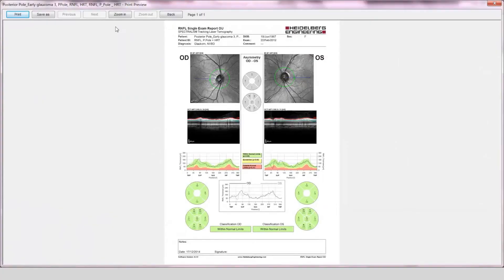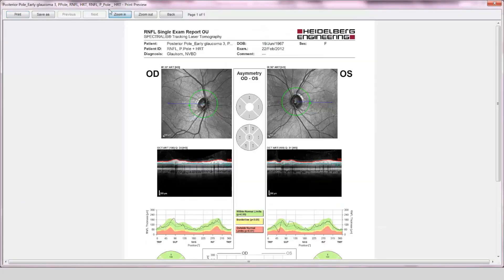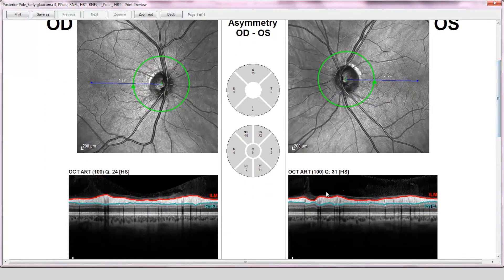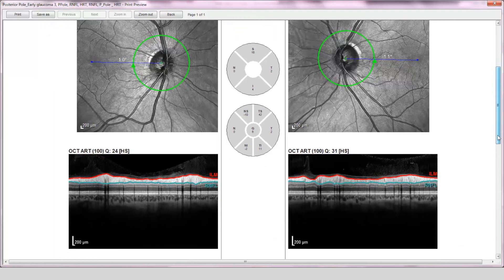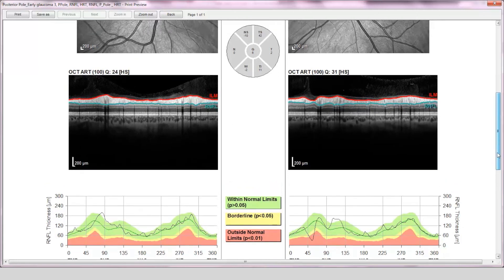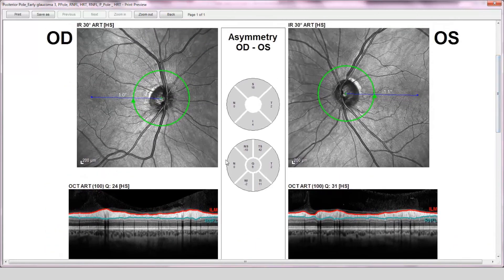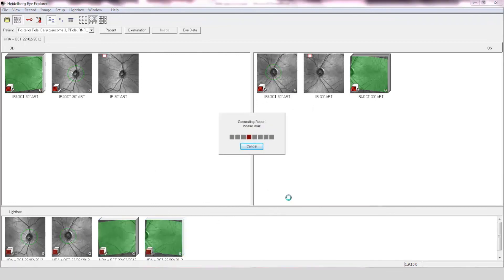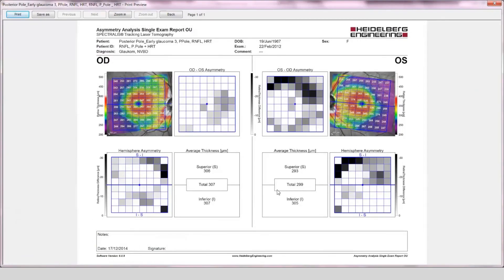The retinal nerve fiber layer OU asymmetry report shows a wedge defect in the left eye, which is confirmed on the RNFL profile, and the asymmetry structural assessment is within normal limits. The posterior pole asymmetry report shows marked OS/OD asymmetry.